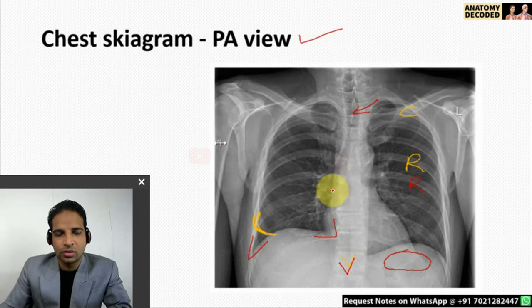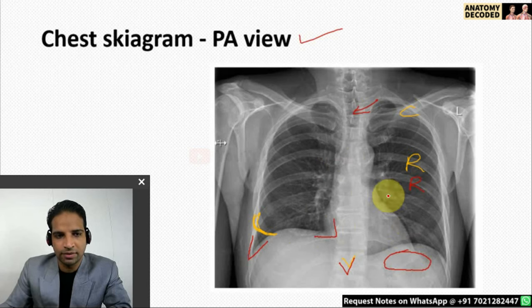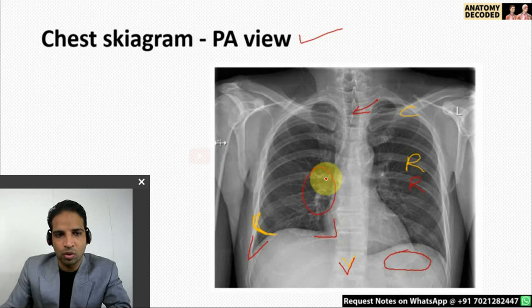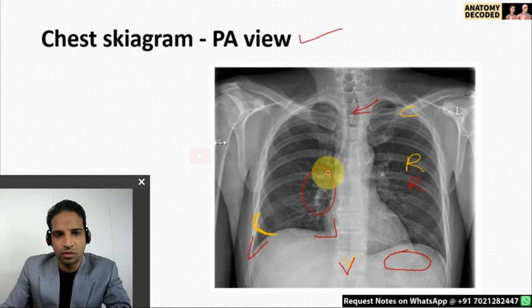In the cardiac shadow, the borders of the heart are important — structures forming the right border and structures forming the left border, which we will see in subsequent slides. In the air shadow, the hilar shadow is seen here — this region is the hilum of the lung, from which the trachea divides into the various bronchi and enters the lung. Bronchovascular markings are seen here, and at times there may be enlarged hilar lymph nodes.